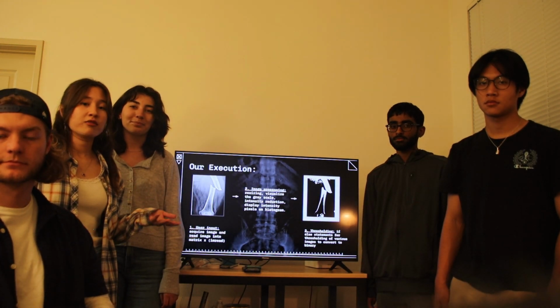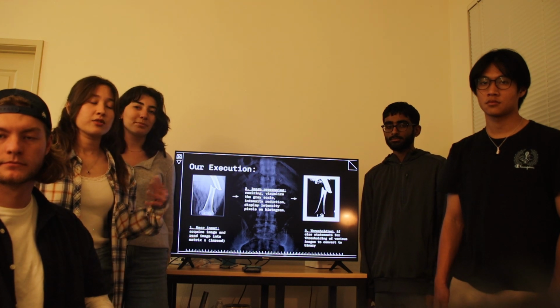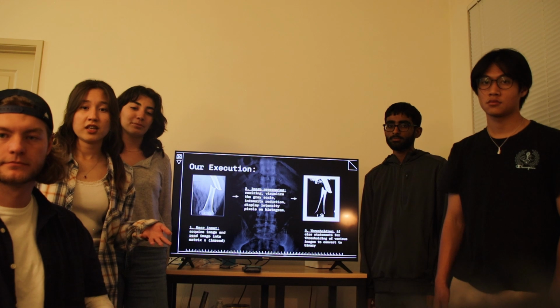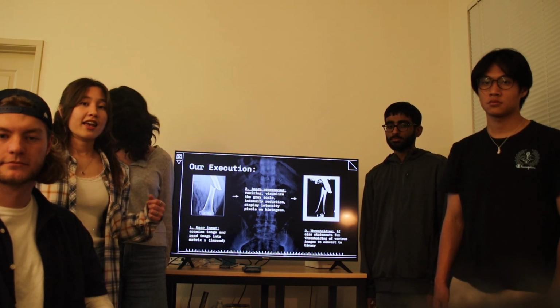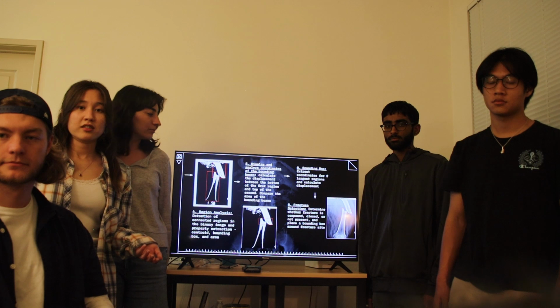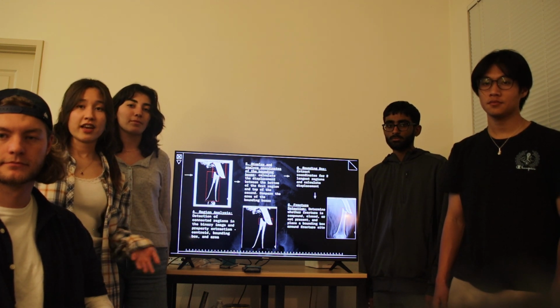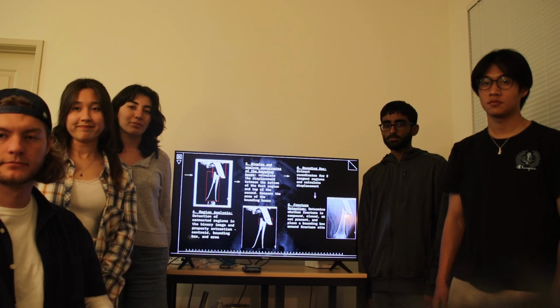So to start off, we did some user input work where you input the image so the file can be analyzed, and then we moved on to some image processing, which is then followed by some thresholding, and then after that we did some region analysis using region props and bounding boxes. The result of that was then fed into direct fracture classification and detection.